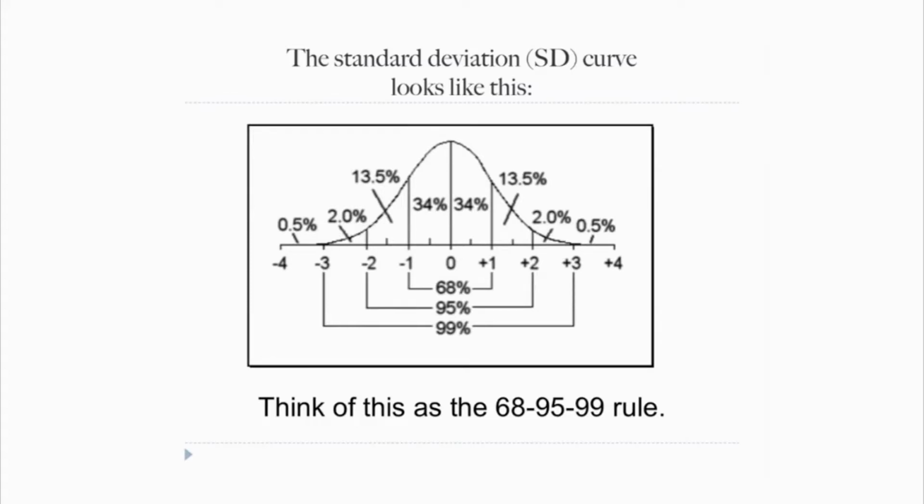When you get out to 4 standard deviations, there's very few people that are 4 standard deviations out. And it's interesting, I looked it up. If you're -5 standard deviations, that's 1 in a million. It's very rare. Now the interesting thing about this, because it's a statistical calculation, 16% of even the 30-year-olds, when we use this statistical calculation, will have osteopenia.